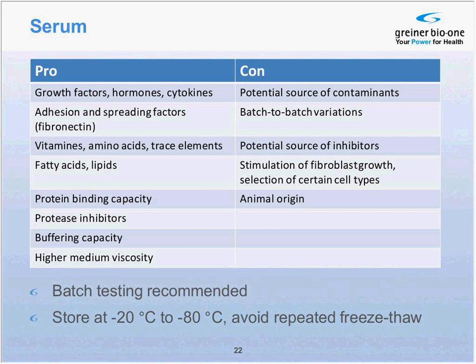In many labs, heat inactivation for 30 minutes at 56 degrees Celsius is performed to inactivate potential contaminants and complement components. However, with the modern filtration methods applied by the manufacturers and the quality standards, it's unlikely that contaminants such as Mycoplasma remain in the serum.